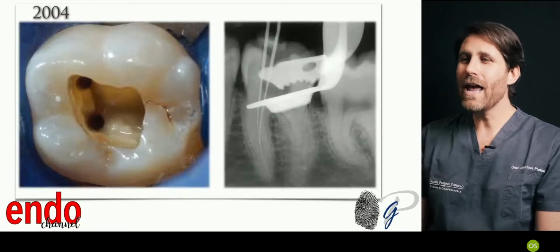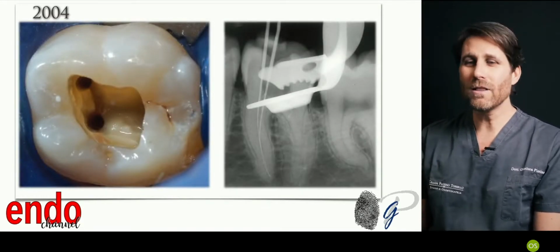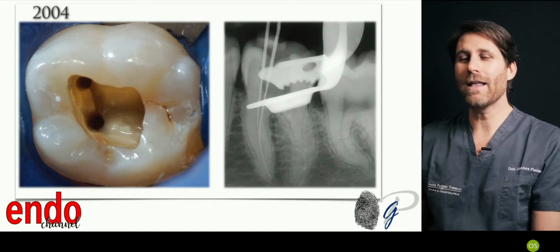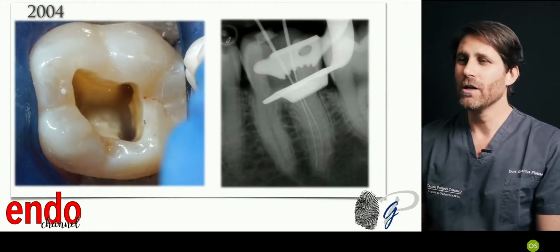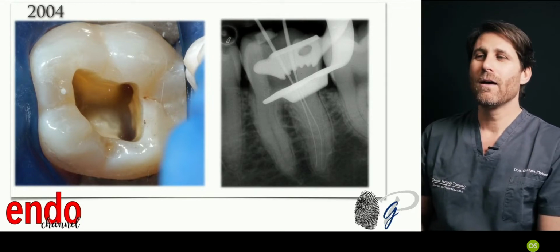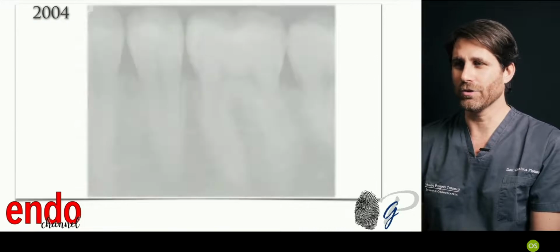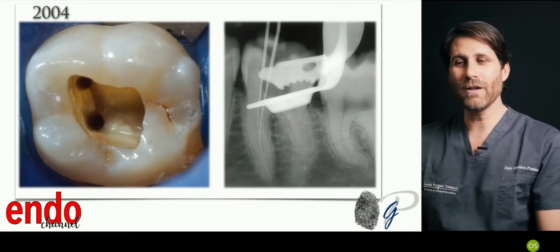In this case, again pulpitis, we have to treat an almost intact crown, just localize the root canal orifices and have a vision of the root canal orifices with different angulation. We can see the two distal orifices just by moving the mirror in one direction, and the mesial orifices in the other direction. So this is something that I already followed at the time.